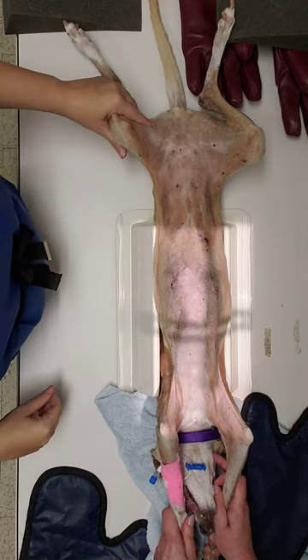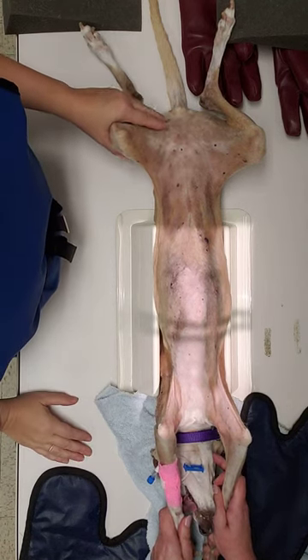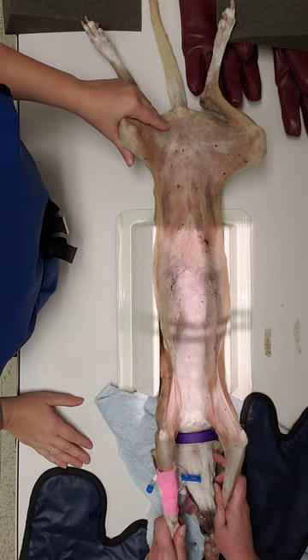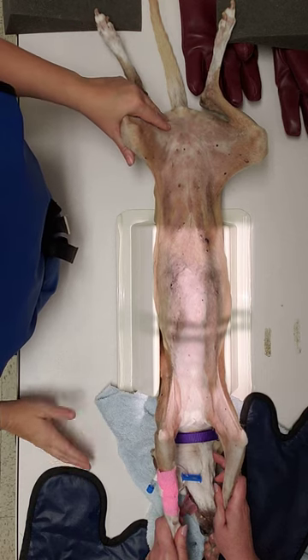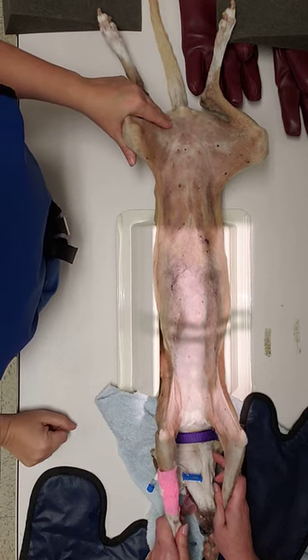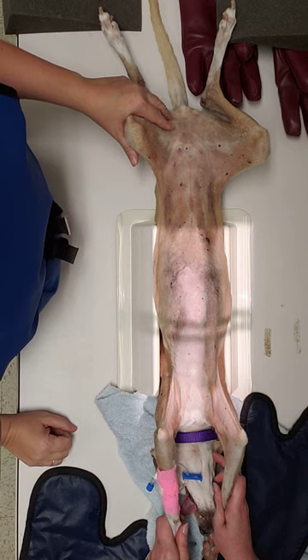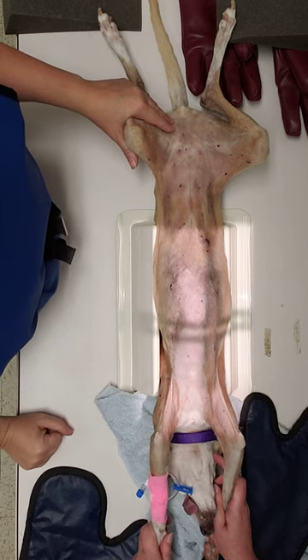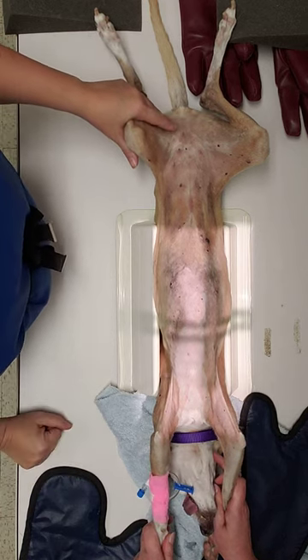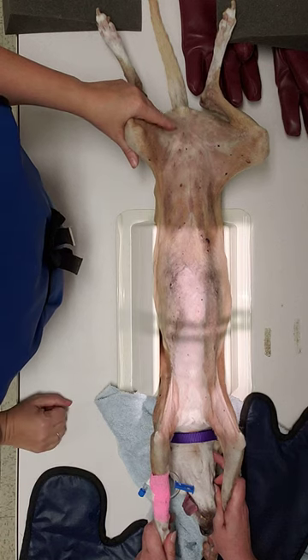Another short video on how to position and collimate for your VD thorax. DV thorax is going to be very similar — they're just turned into sternal recumbency or ventral recumbency because you're going to need their heads laying a little bit more flat.